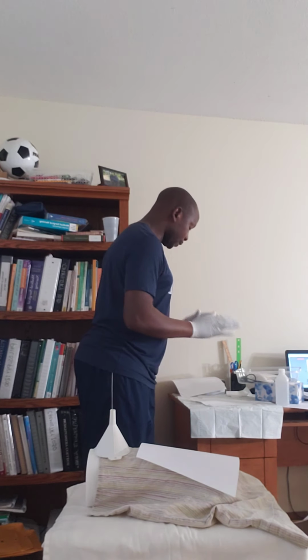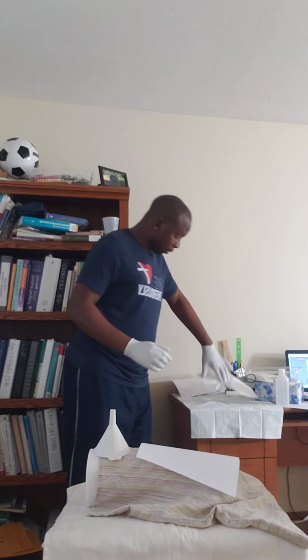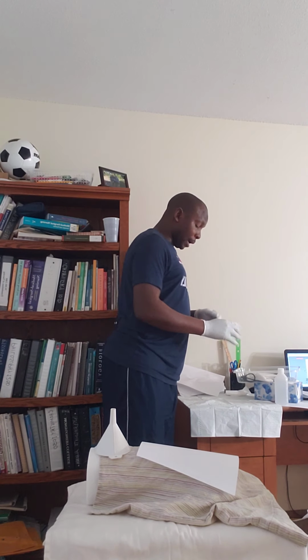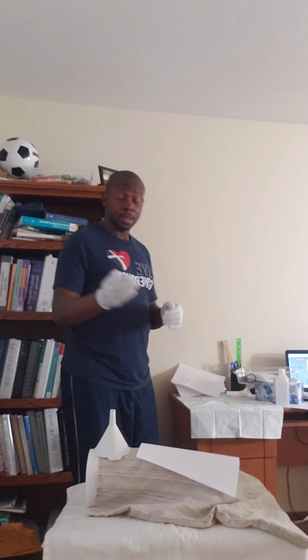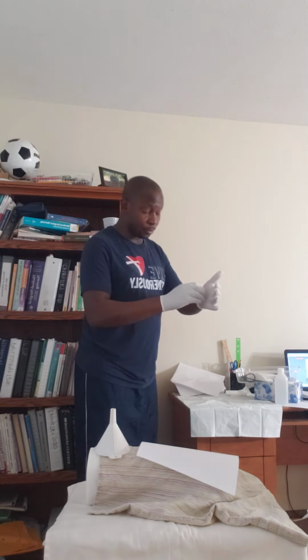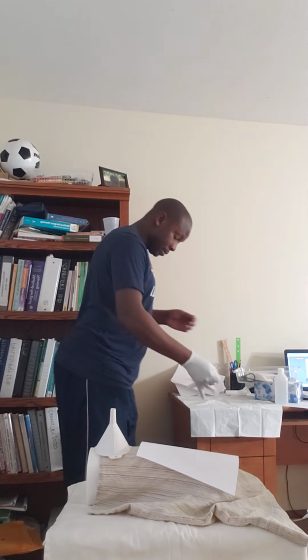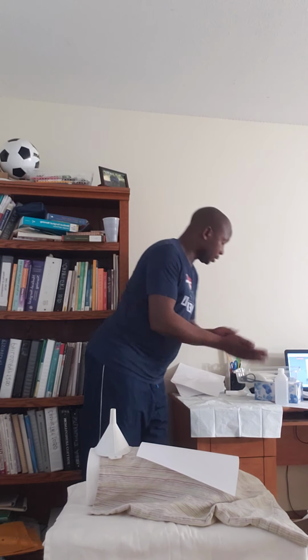Okay, now gloves are on. And then I can use this one, like you see in the middle, and throw it on to create my good environment. Now, if I make a mistake like now, and I have another set of gloves, I can remove this glove and this one, and wash my hands.